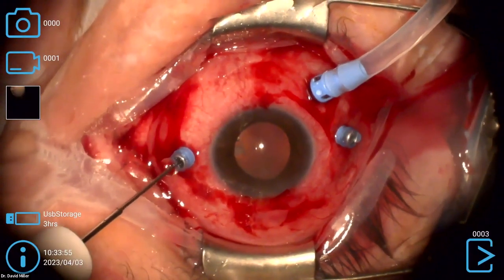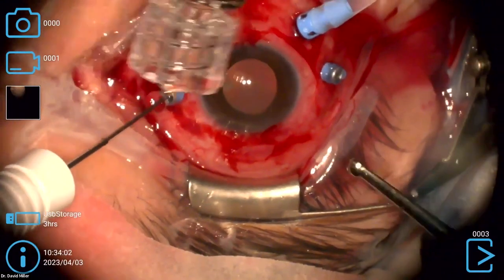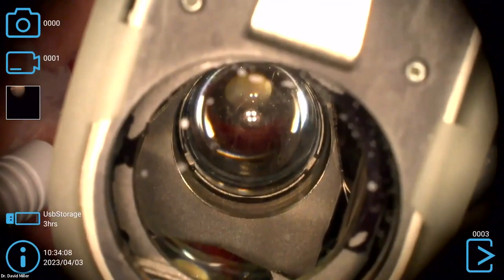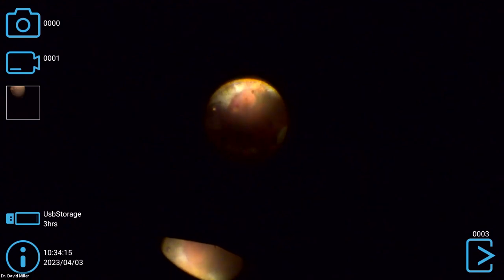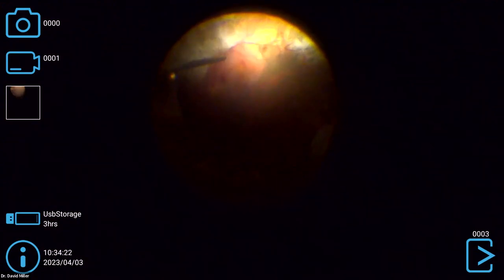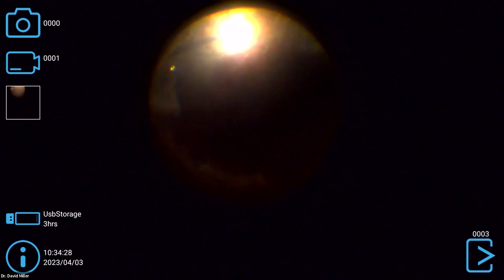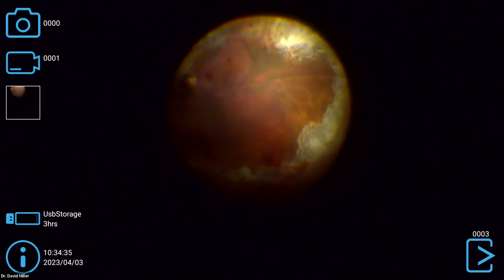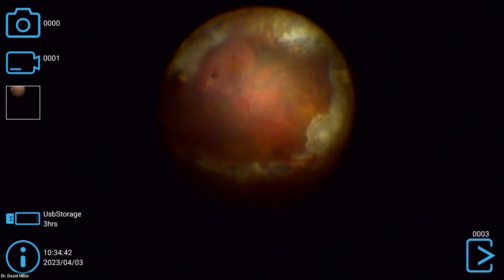So let's take a look here in the peripheral retina. Make sure we're nicely attached before we put the gas in. Don't touch. We'll try and get pretty good focus. So you can see the peel, almost the entire macula was peeled in this case. Took a lot of scar tissue away from this epicenter proliferation right here, which we're going to leave alone. All this white. The peripheral retina is still nicely attached. So the prior surgeon did a nice job keeping this retina on for us to get to this point.